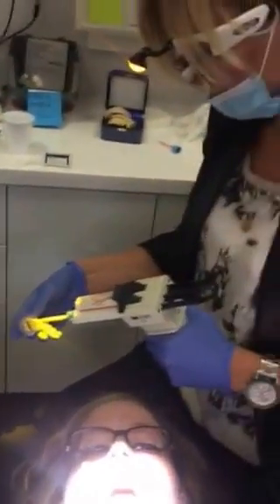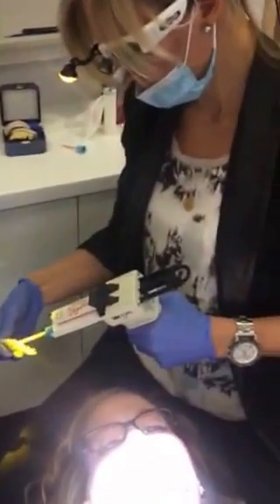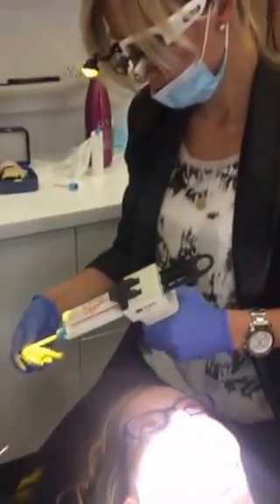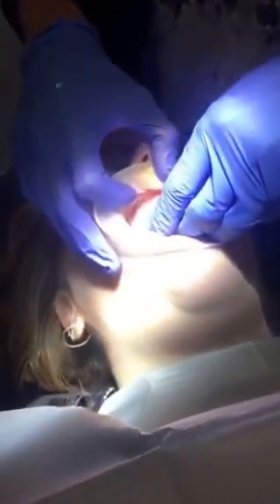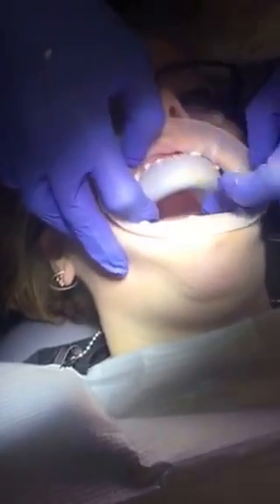Okay, don't panic or anything, it should be fine. Last week I didn't fill this quite as much as I should have and I had to redo it, so I'm gonna fill it a little bit more today. I'd rather have a little bit extra than not enough.